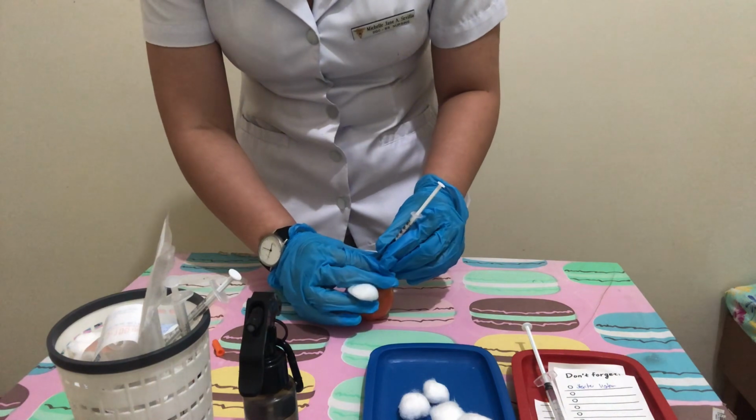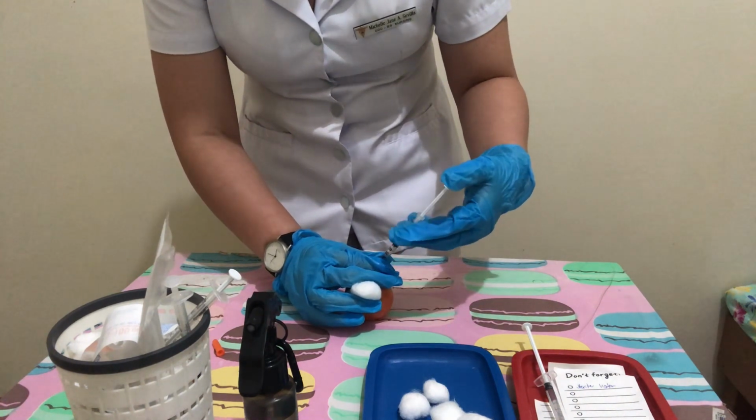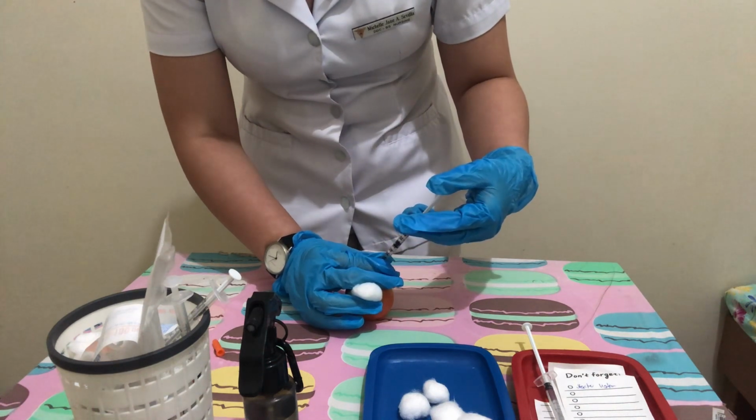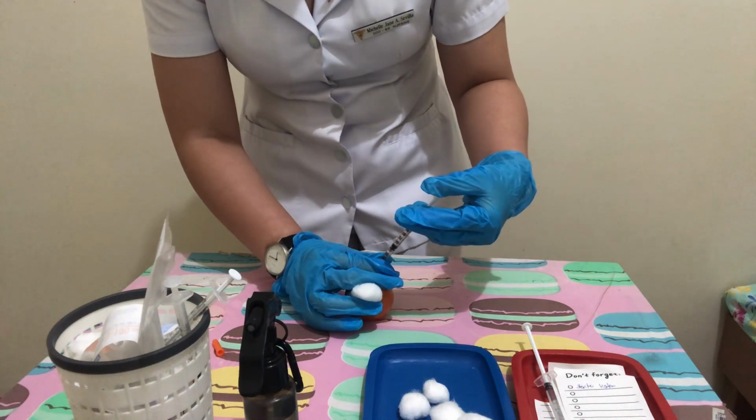So pain is minimized by inserting the needle without hesitation. So when the needle is inserted, rest the non-dominant hand on the barrel and move the dominant hand to the end of the plunger and slowly inject medication over several seconds, holding the syringe steady.